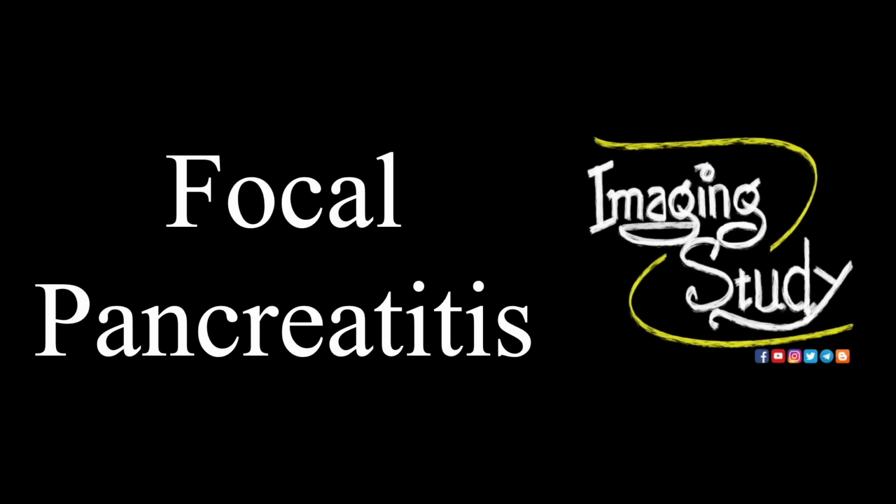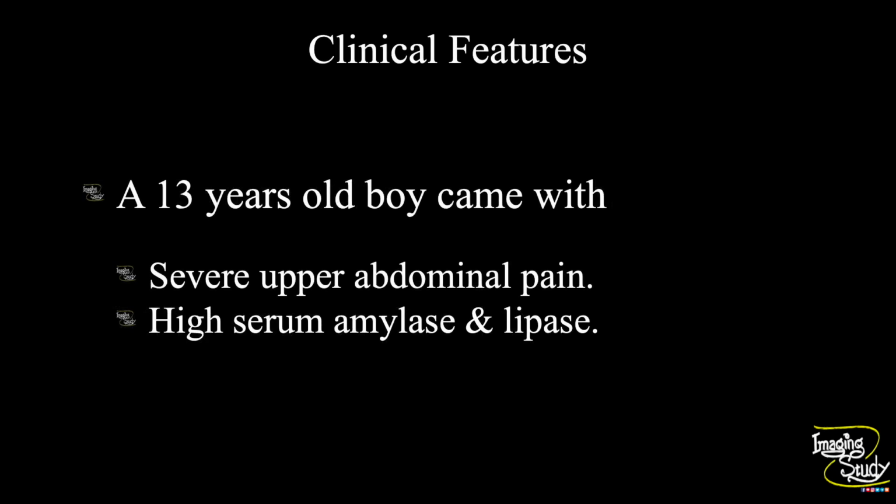Today we are going to see a case of focal pancreatitis. A 13-year-old boy came with severe upper abdominal pain. We have got the biochemical findings of this patient and the serum amylase and lipase were high. Let's see what we have got on ultrasound.